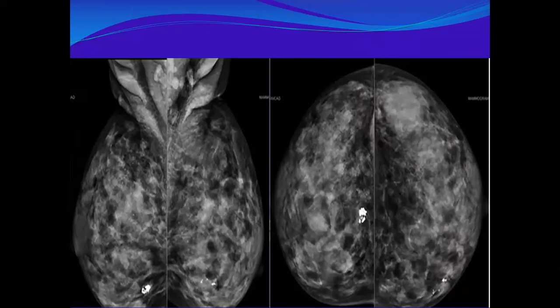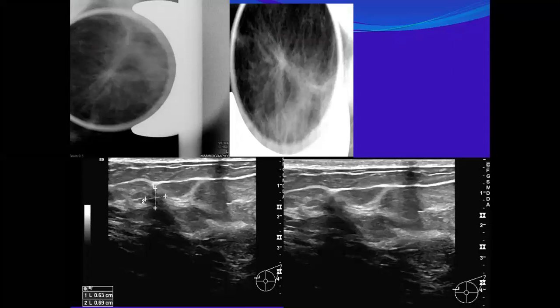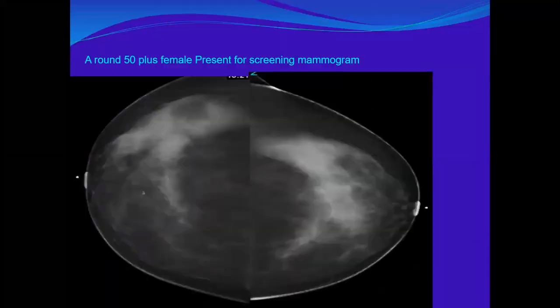Quickly. We want to go through many examples. Dr. Rabab, for the previous patient, the first image. Here? Yes, yes. The right breast, what about the hypodense area in the upper part? Can I consider this a normal variant? This area? Is it asymmetry? No, this is a fat lobule.